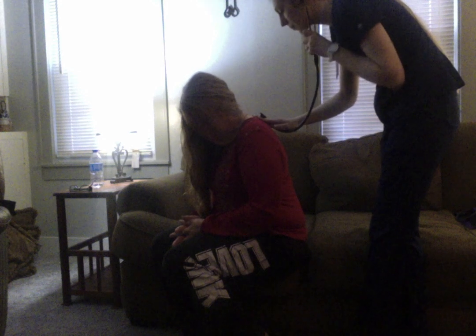Alright, now we've listened to the front. We'll go ahead and have you sit up and we'll listen to the back as well. And we'll do the same thing, just take a deep breath every time I move my stethoscope. Okay.